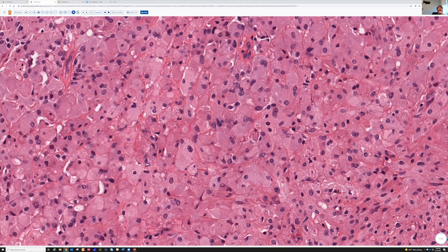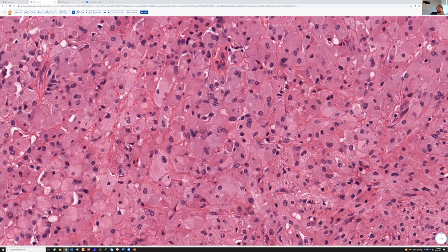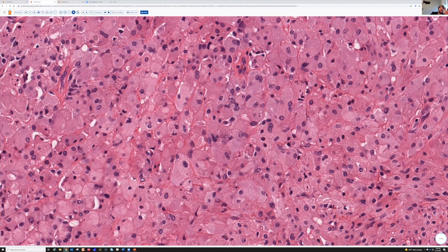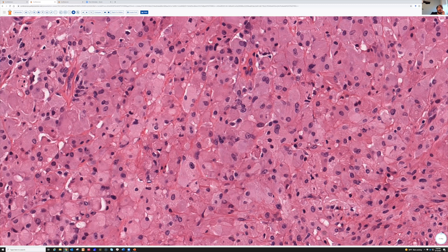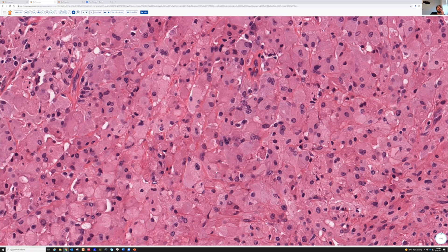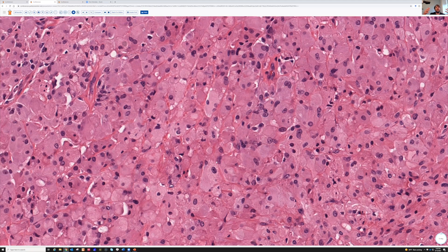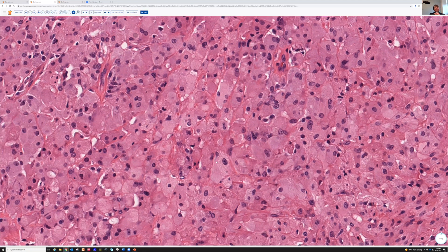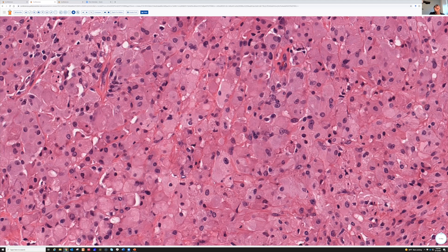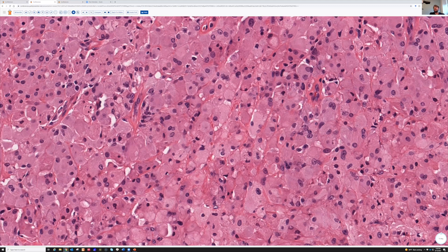A granular cell tumor is a great idea, but that's not what it is. The cytoplasm does look kind of the same color as granular cell tumor, but in granular cell tumor the cells all fuse together and make a syncytial sheet. Here you can see a discrete outline of each individual cell — they have their own distinct cell membranes.